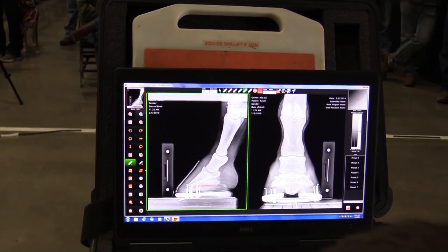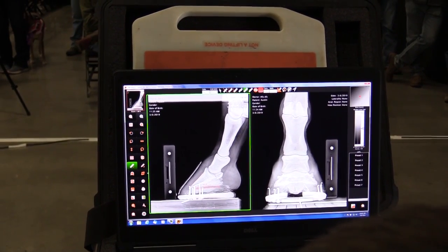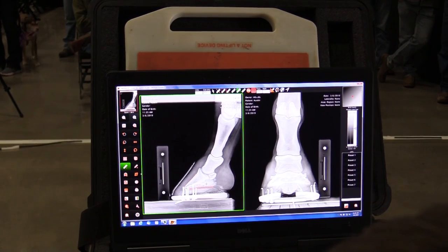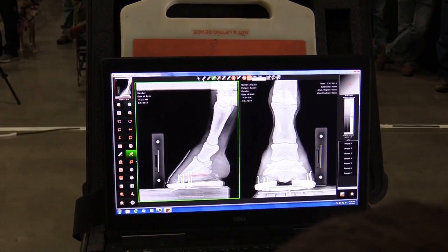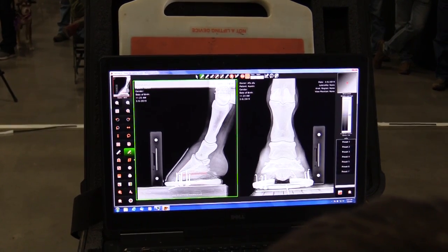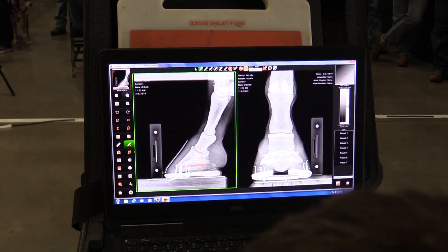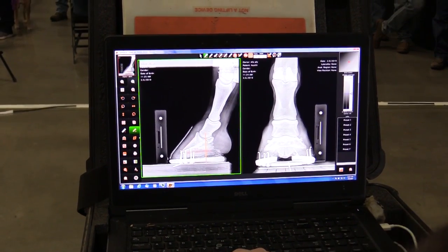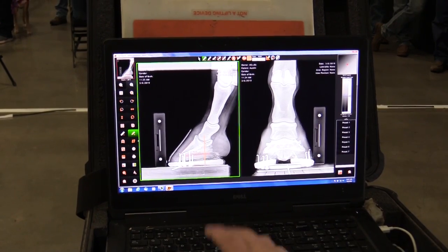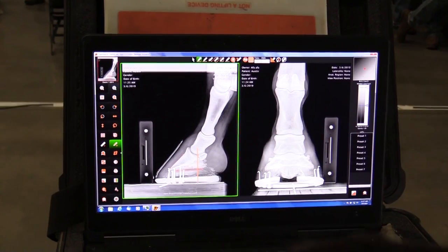Measure the palmar angle. That's the bottom of the coffin bone relative to the level world. About 2.4. And again, we're looking from the center of rotation forward. There's a lot of leverage out front, and these are tough ones to maintain because of that. I'm not saying that 50-50 is ideal. I don't know that anybody really knows what ideal is, but I know a lot greater leverage reduction is better than none.